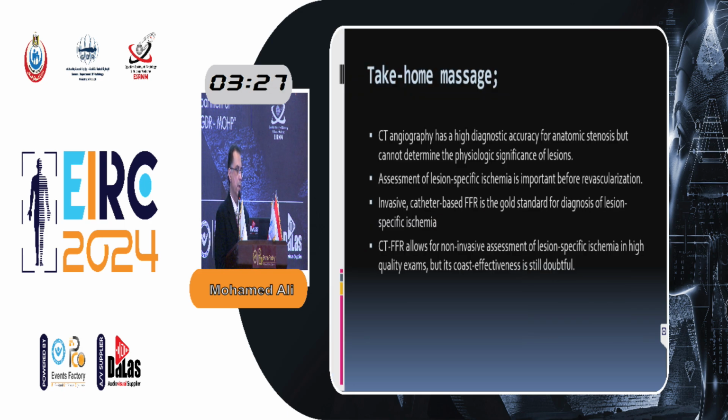And finally, the take-home message is that CT angiography has a high diagnostic accuracy for anatomical stenosis, but cannot determine the physiological significance of the lesion. Assessment of lesion-specific ischemia is important before revascularization. Invasive catheter-based FFR is the gold standard for diagnosis of lesion-specific ischemia.